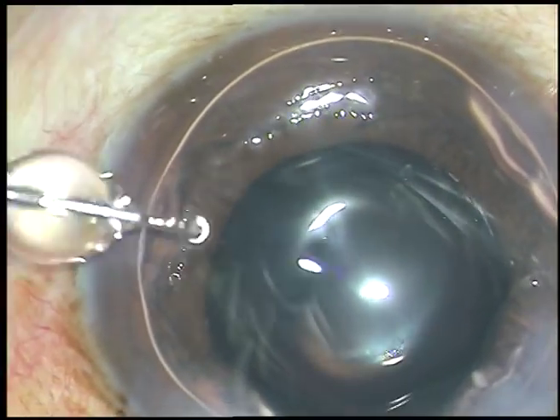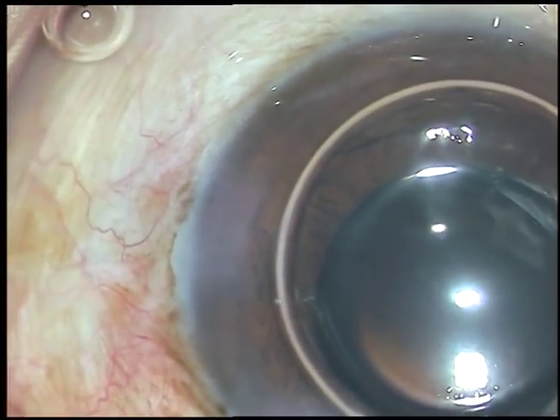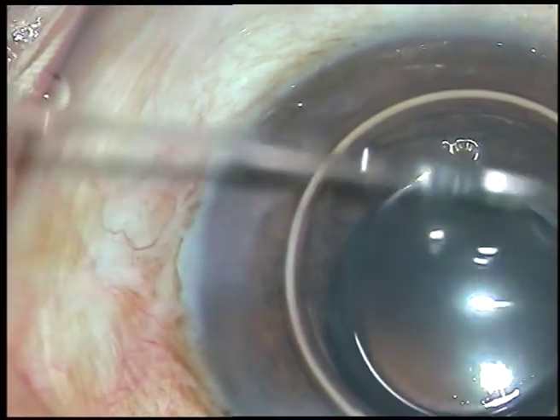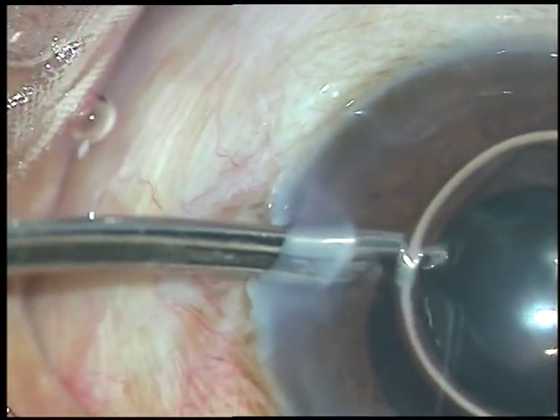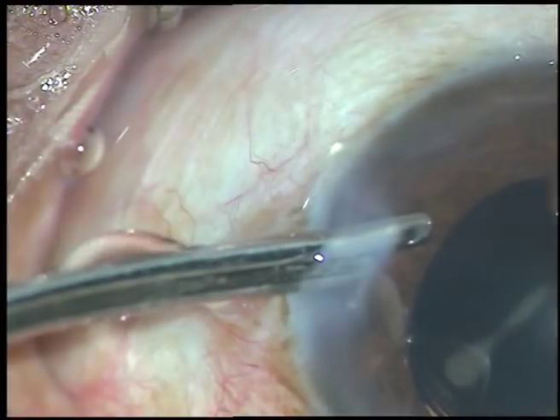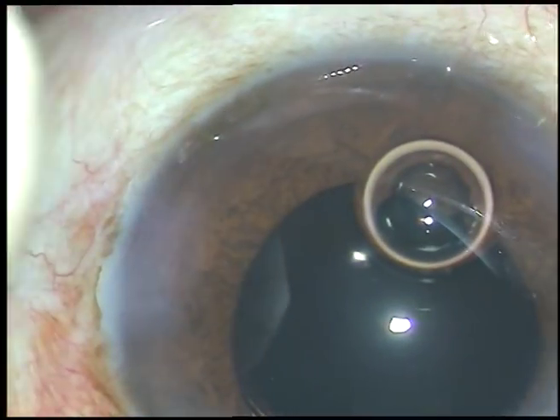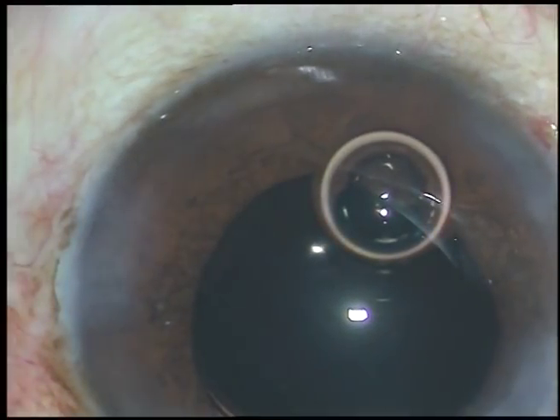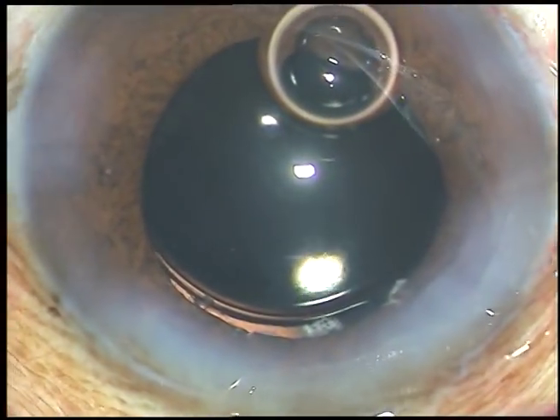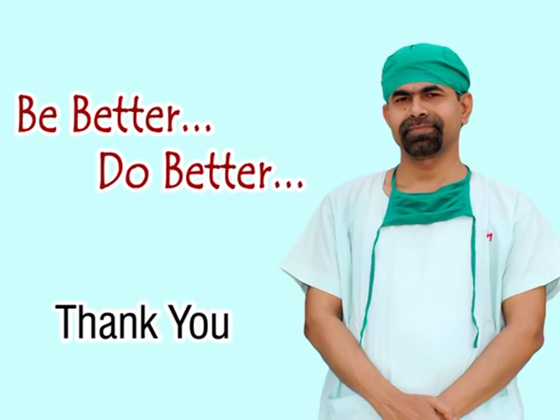Now I seal the wounds, inject a bit of moxifloxacin, and then replace the air with BSS. If we do a nice vitrectomy, the result is very good in such cases and the patient gets very good vision. Before we conclude, we must check the intraocular pressure and check that there is no leakage from any site. Thank you very much for watching. Hope this video will encourage you to take on challenging cases, learn anterior vitrectomy, and do very well in your practice.